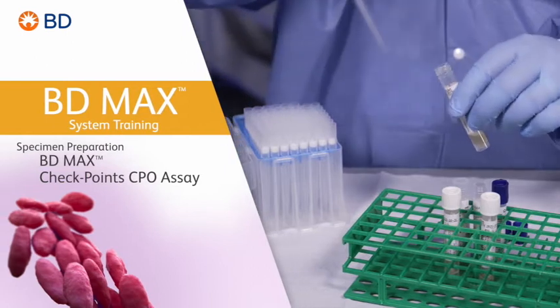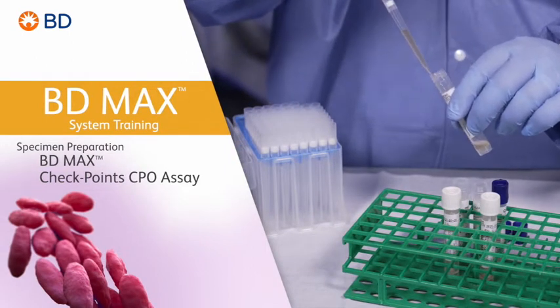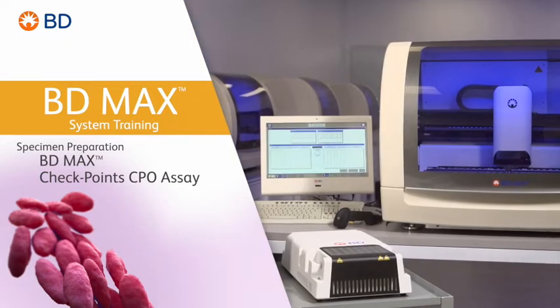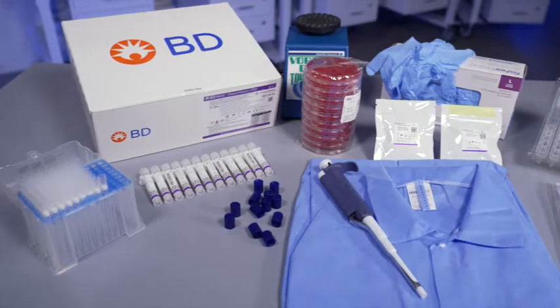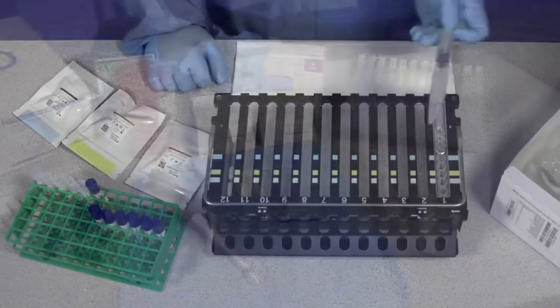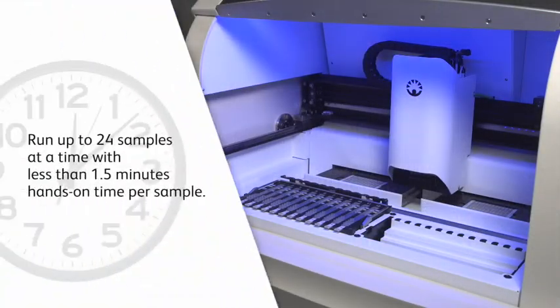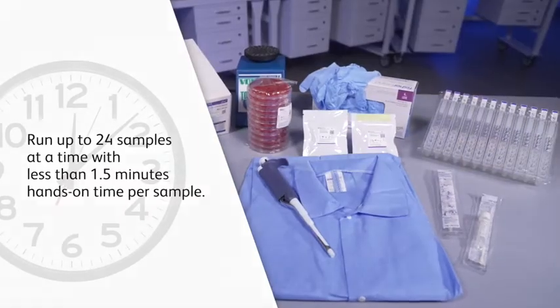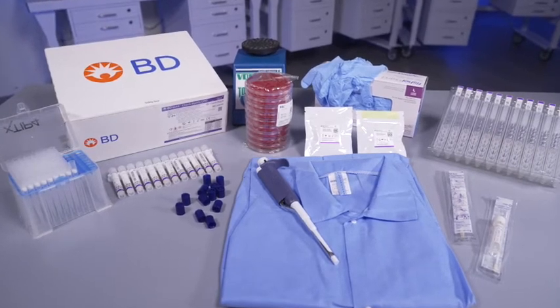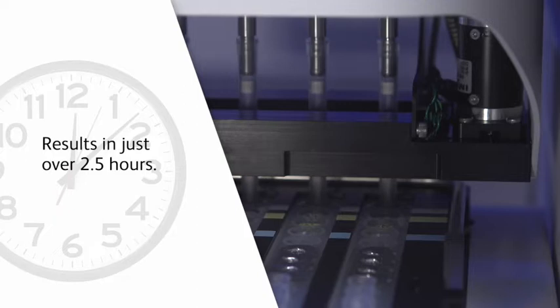Welcome to the training video on the basics of proper sample preparation for the BDMAX Checkpoints CPO assay, performed on the BDMAX system. The BDMAX system offers you a simplified and automated workflow, allowing you to run up to 24 samples at a time, with less than one and a half minutes hands-on time per sample. The BDMAX Checkpoints CPO assay can provide results for 24 samples in approximately two and a half hours.